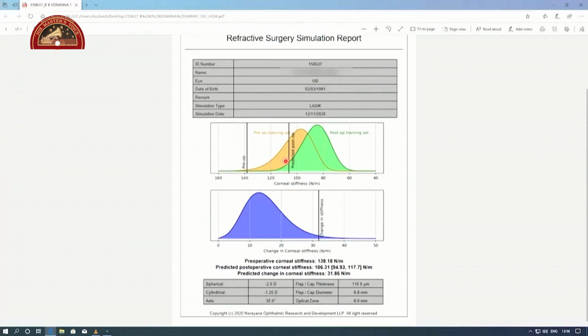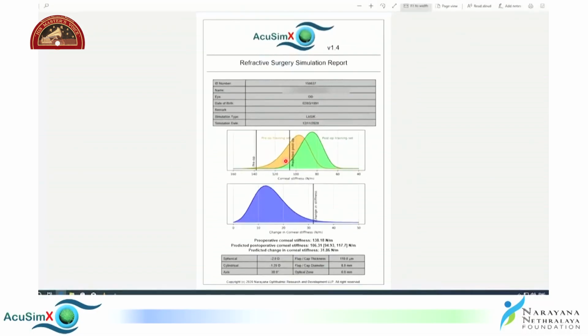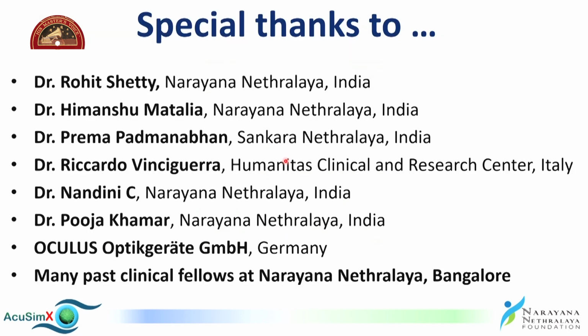And then once the simulation is completed, we give a nice report. And we also give a guideline, a guidance to the surgeon with respect to the decision nomogram that you saw in the previous slide.